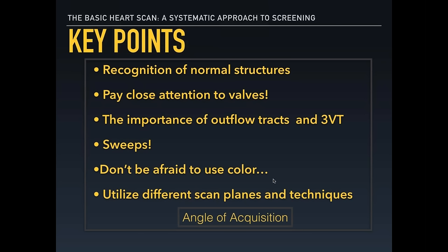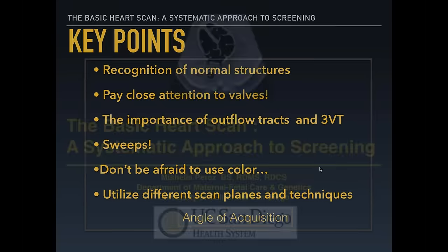Also, don't be afraid to use color Doppler. If color Doppler is something that you're not used to applying, practice makes perfect. With every scan that you do, you could apply color and try to practice. Also, utilize different scan planes and techniques to adjust the correct angle of insonation, depending on what structure you're trying to evaluate.